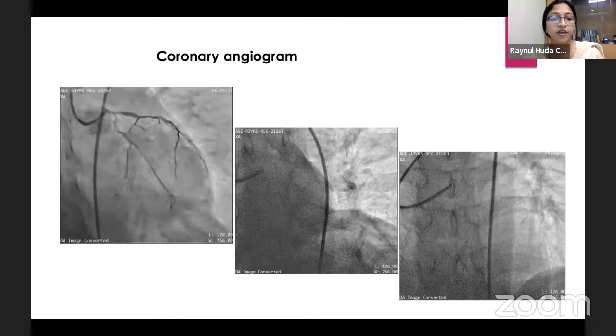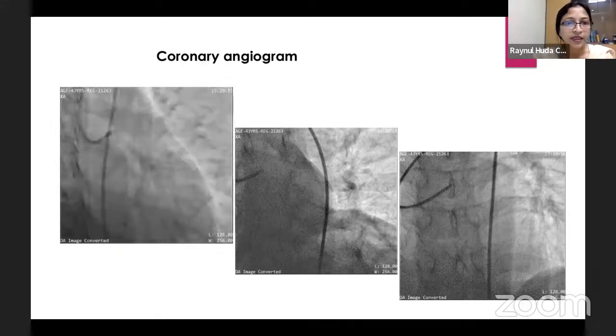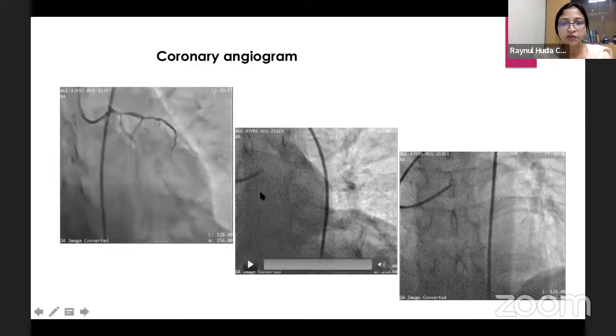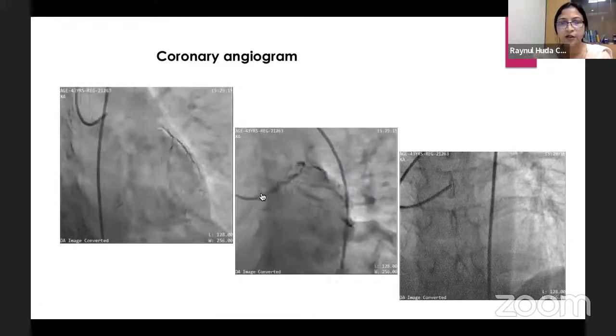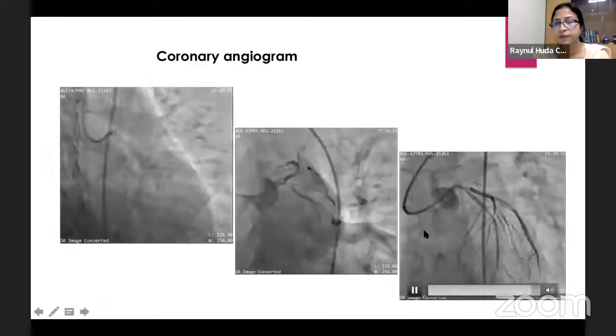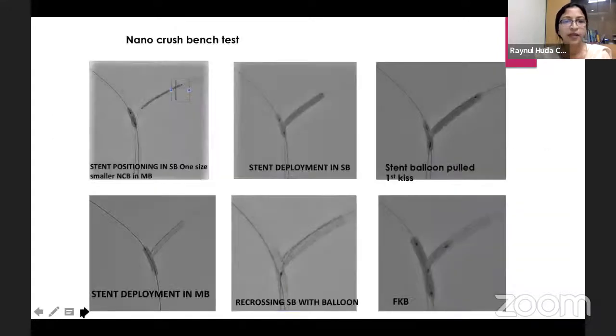His heart rate is very high, and the angiogram showed a tight lesion in the distal left main, also involving the LAD ostium and LCX ostium. So we are dealing with a case of bifurcation lesion, and obviously we have to plan a double stent strategy for this case.